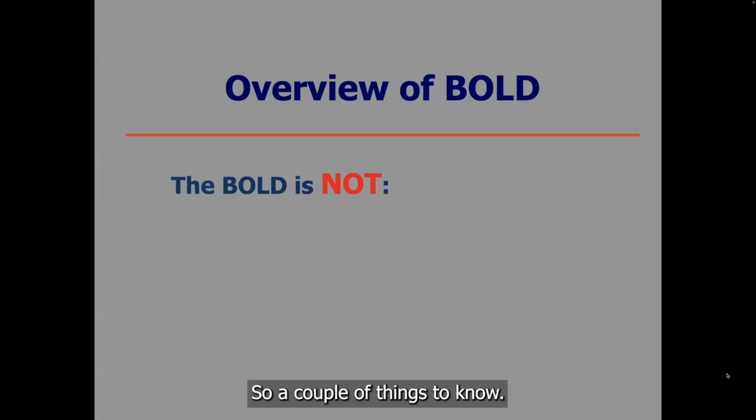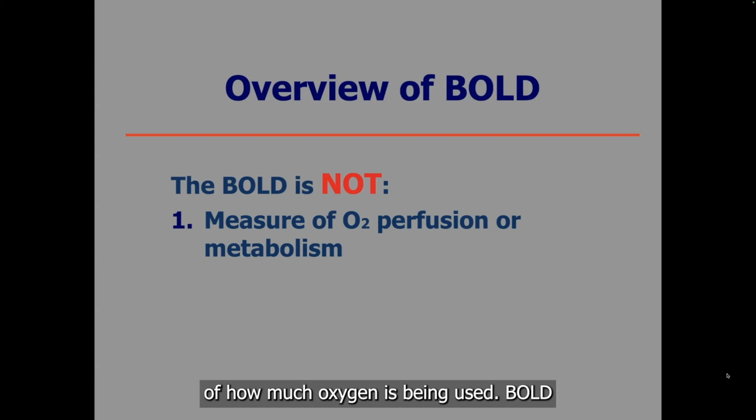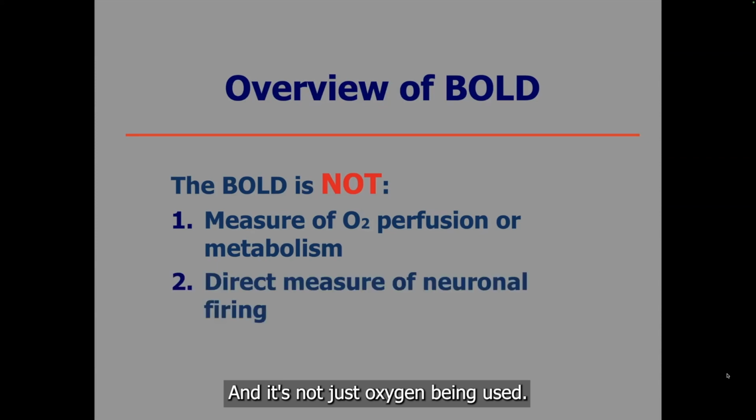So a couple of things to know. This blood oxygen level dependent signal, the fMRI signal, is not a measure of oxygen perfusion. It doesn't tell us, like PET in a previous module can, an exact measure of how much oxygen is being used. BOLD has a number of different parts to it, and it's not just oxygen being used.